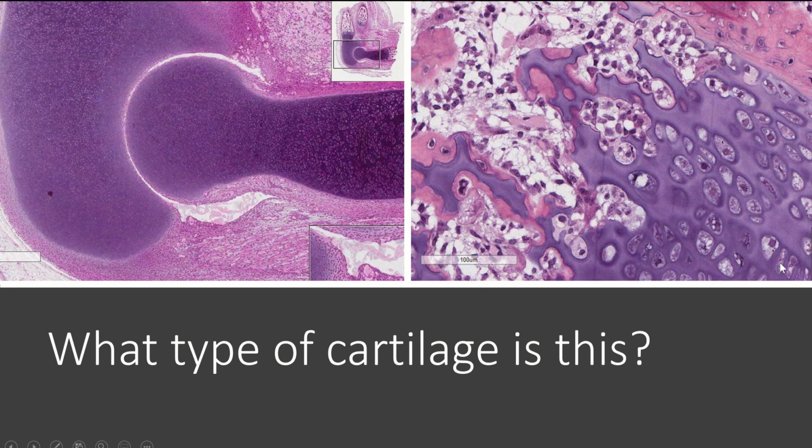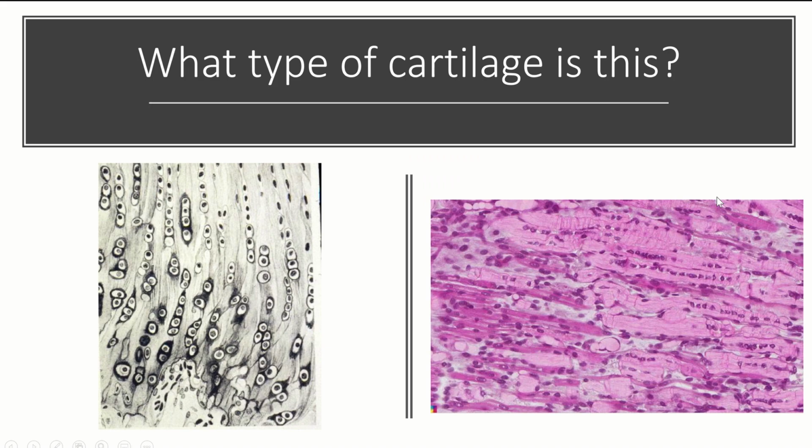Okay, and then here you can see there's that hyaline cartilage, and this is actually from the transition site. So this is the hyaline cartilage turning into bone, and we'll go over that in a little more detail in a second.